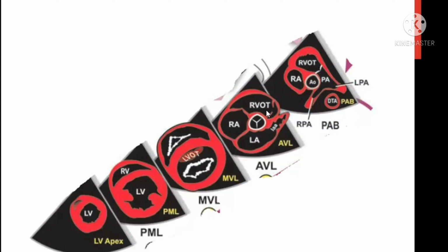Next, this is the aortic level. So this is the Mercedes-Benz sign. You know Mercedes, right? So the Mercedes-Benz sign. These are the three coronary cusps. Okay, right, left, and non-coronary cusp. Right atrium, right ventricular outflow, then left atrium. So this is what you see in parasternal short while you are looking at the aortic level.